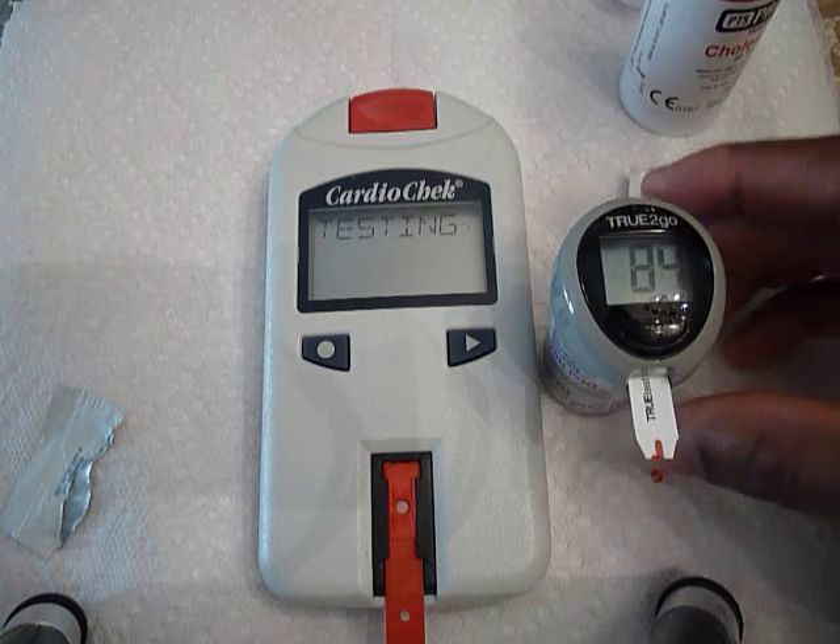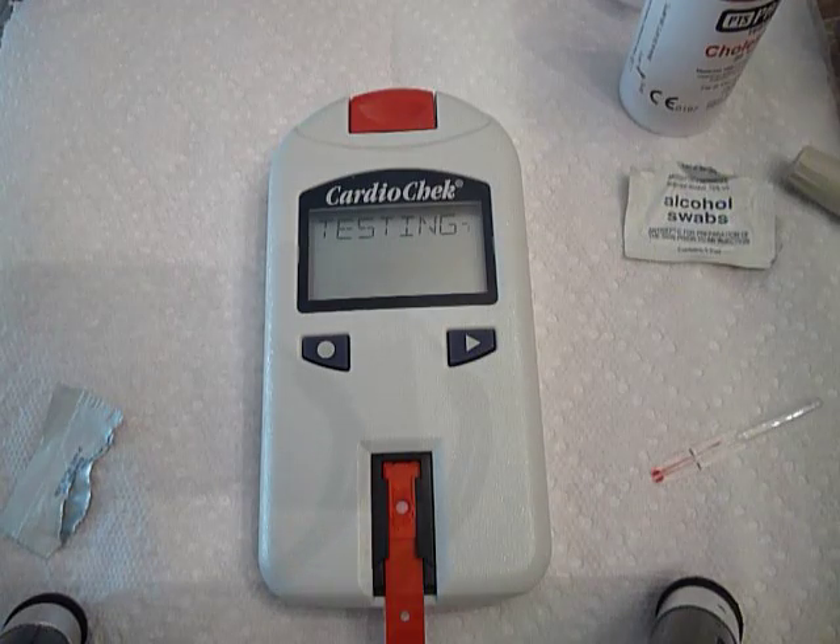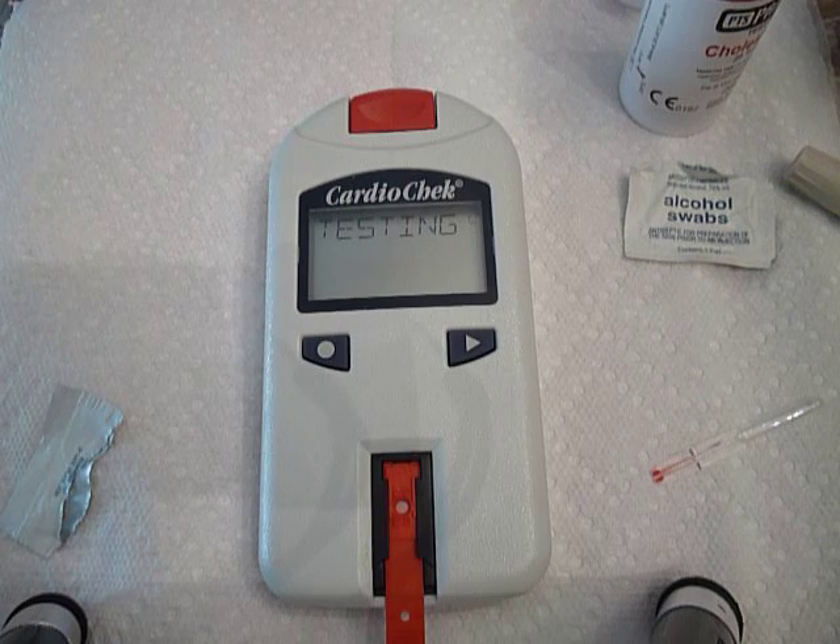For today, my blood glucose level is 84, which is pretty good. This is all real time, so this will give you an idea of how long it takes.